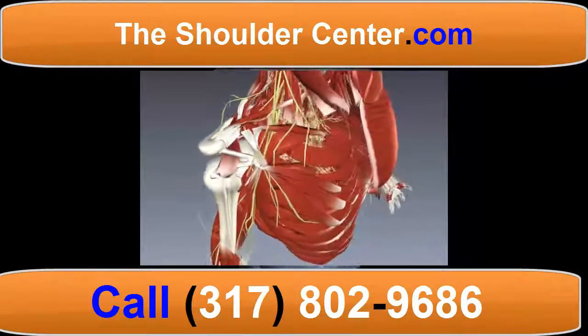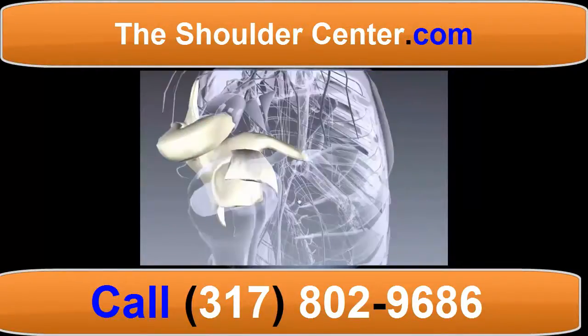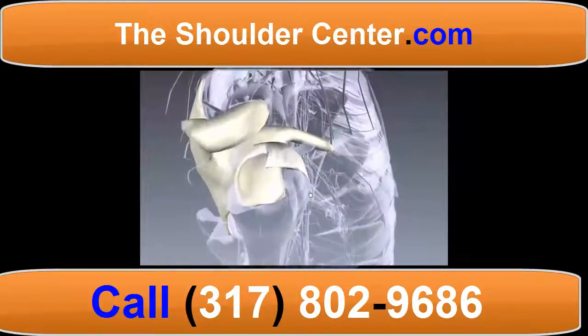Starting at the superior glenoid neck, the superior glenohumeral ligament is intimately associated with the supraspinatus tendon.